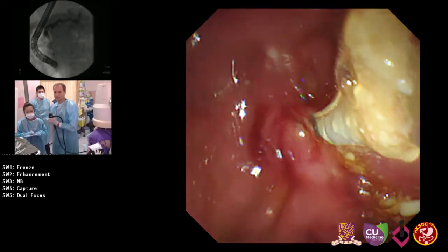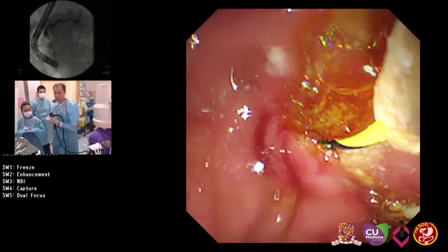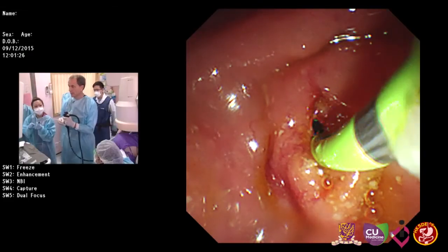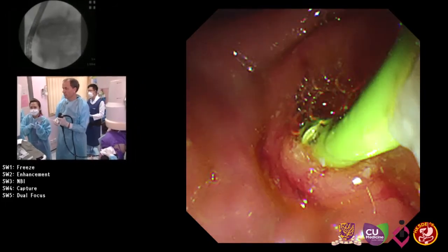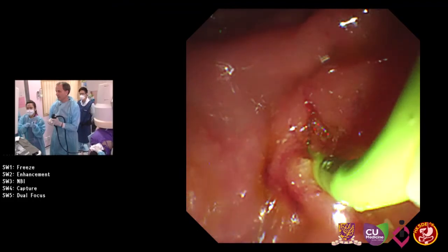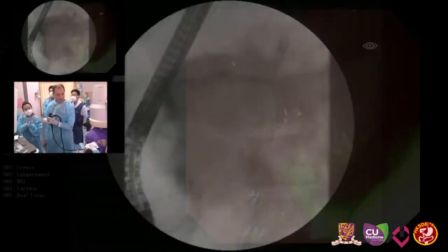Very good. So while you are placing the stent, we go back to the OT first. Okay, thank you, Horst. Yes. So what are you doing? We place now a 7 French, 7 centimeter pancreatic stent. Why 7? Why not a bigger one?